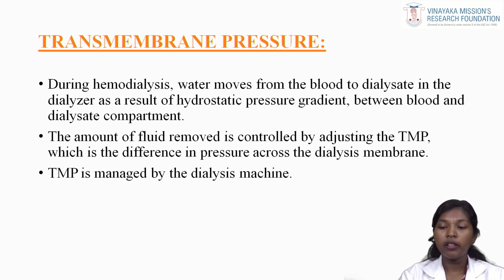The excess fluid is removed from the blood to the dialysate compartment only because of the hydrostatic pressure.